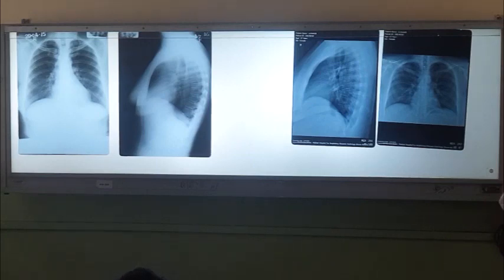Whenever you want to do an X-ray at some other site, for example a knee joint X-ray for a patient with knee joint swelling, there is always an indication for a chest X-ray. Say there is a patient with headache and you are doing a skull X-ray or CT scan brain, there is an indication for a chest X-ray because the primary pathology may be in the chest.